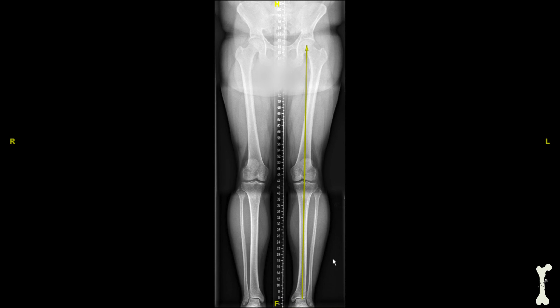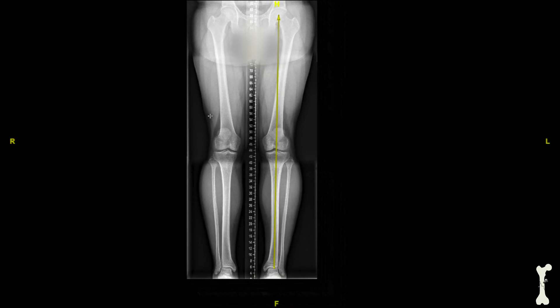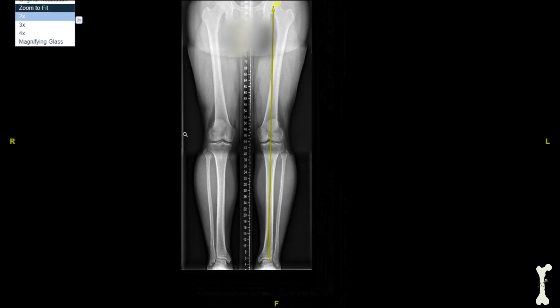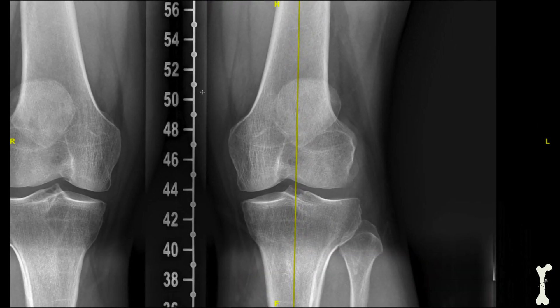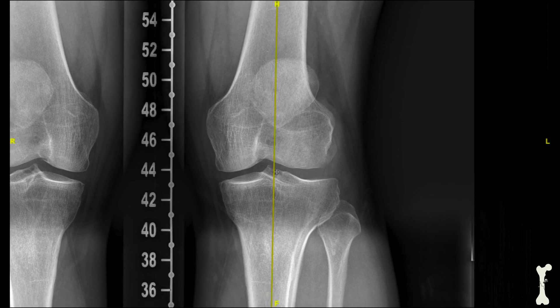After that line is drawn, we can see that the patient's mechanical axis — really the load that passes through the extremity — passes right through the middle part of the knee joint. Zooming in on the knee joint, we can see how the yellow line passes pretty much right through the middle of the knee joint. When the mechanical axis passes through the middle of the knee joint, we call this neutral alignment.